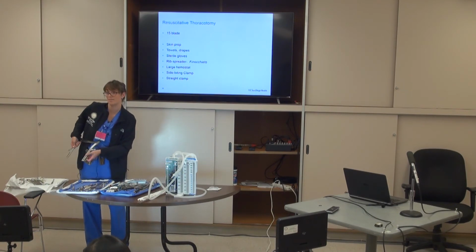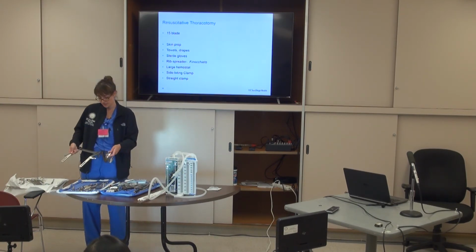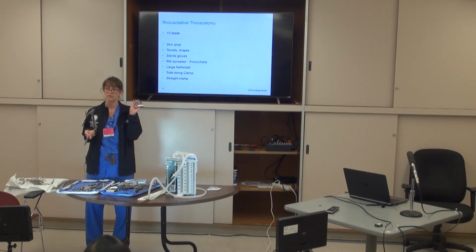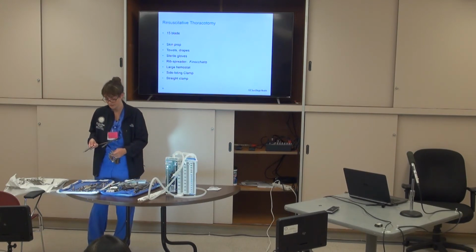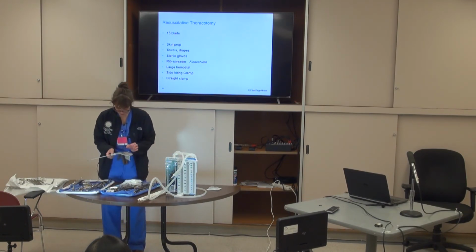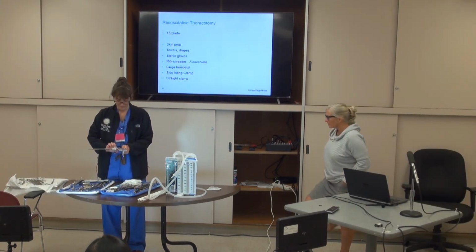Oh no, it's not that I'm not putting it in the hole, it doesn't fit. Okay, so this kit has pieces that don't fit. So don't panic if it doesn't work. It's not you, it's the kit. Get another one. All right, so we move on to ones that might work. And then you're showing the one that's already put together.